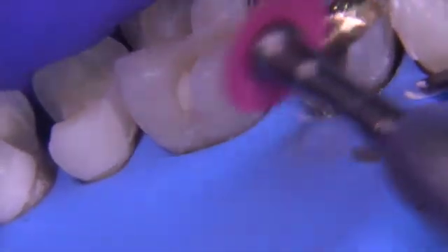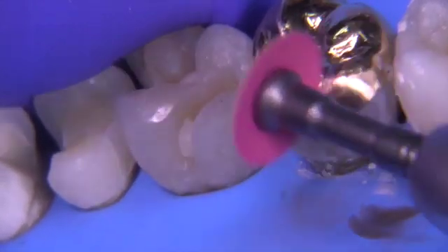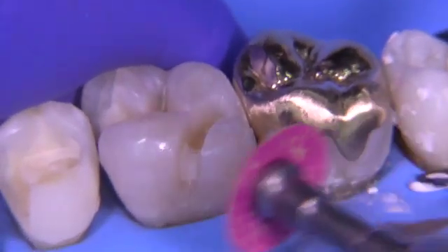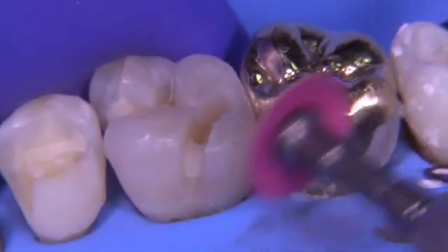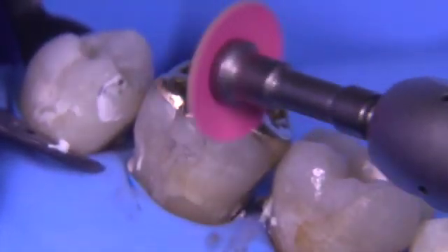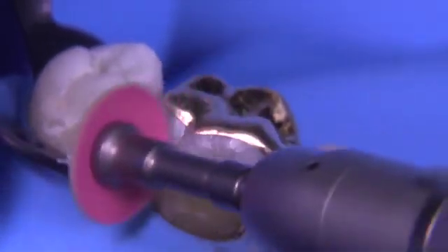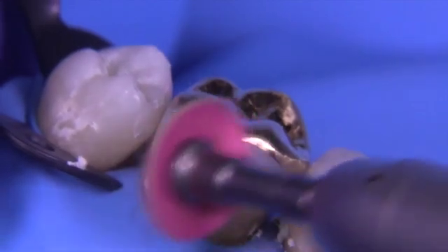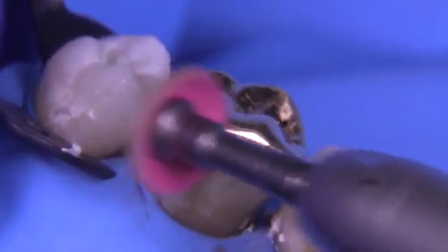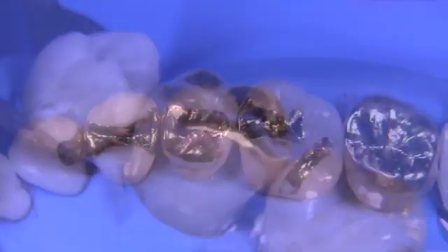This disc can be used extensively even when it gets floppy — you can spin it at a higher rate of speed with a lighter touch, and actually start the polishing sequence with it. I like to make sure all scratches are uniformly small at the completion of this disc. It's also good to start in the groove areas before rolling onto the more convex areas — Dr. Tucker Jr. always advised to start with the disc in the groove and then move out onto the more convex surfaces.